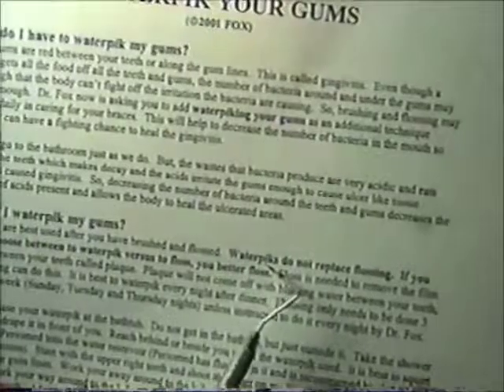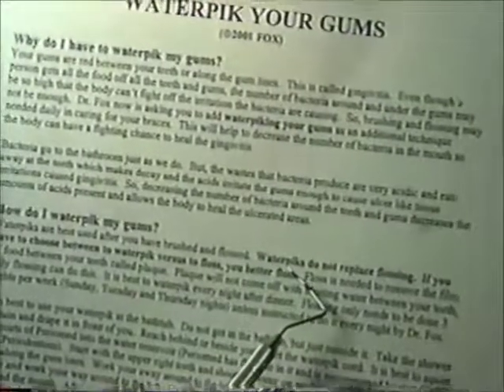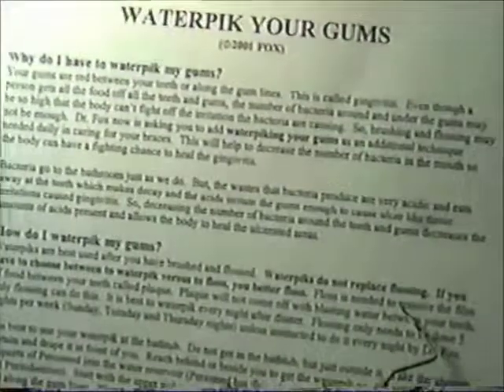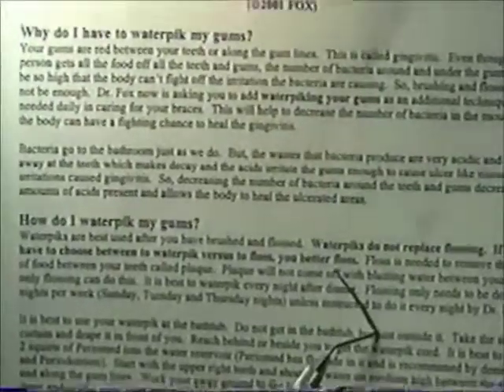The last thing I want to make sure of is that Waterpiks do not replace flossing. Waterpiks are not strong enough to get the bacteria and the plaque, the gooey, doughy film which is composed of sugar and bacteria, and it's not strong enough to actually shoot it off of your teeth. You have to rub it off. You either have to brush it off or use floss to rub it off, and I caution you not to use electric flossers. So if you have to choose between water picking and flossing, you better floss.